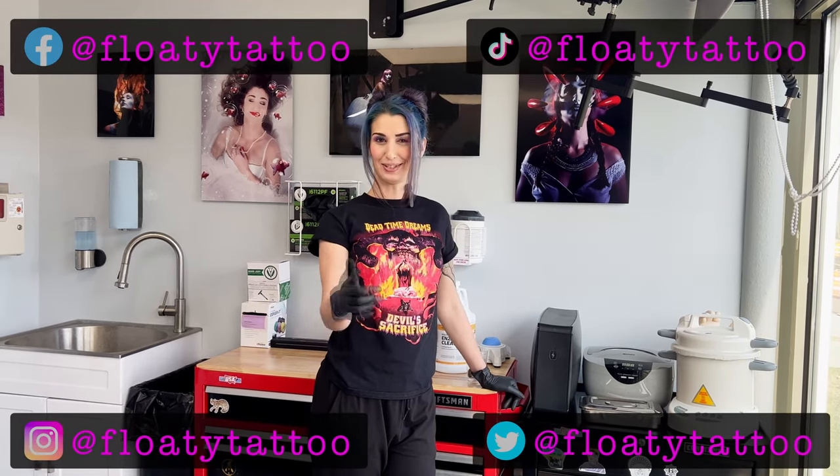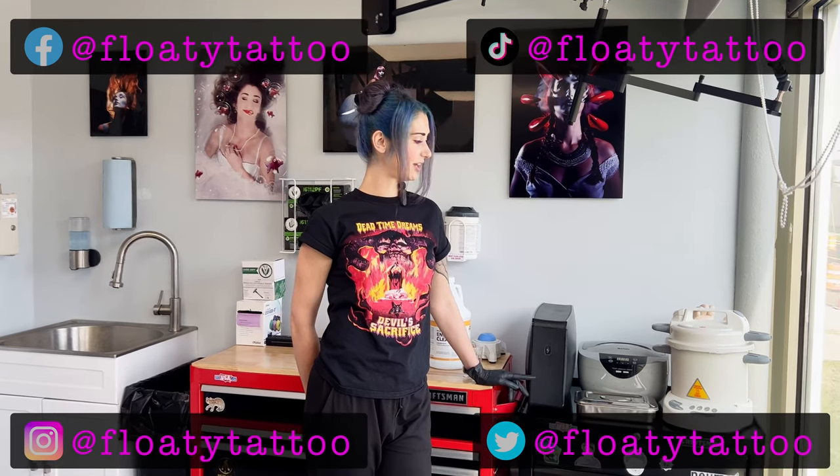Hey guys, welcome to Floaty Tattoo Studio. I promised I'd do a tutorial on my autoclave — the Classic Prestige, available on Amazon. So without further ado, let's do a tutorial on how to clean it, how to maintain it, and how to do your spore test. First things first, I'm going to show you how to sterilize your grip.